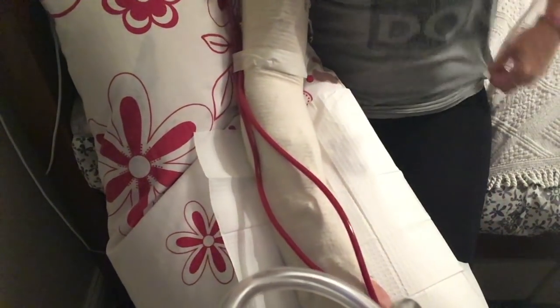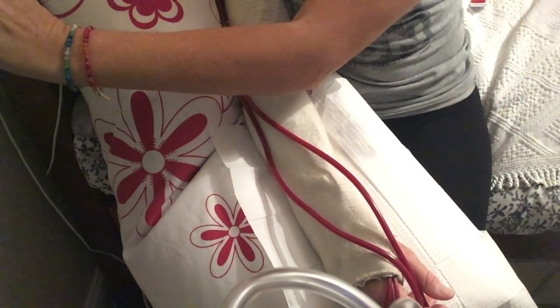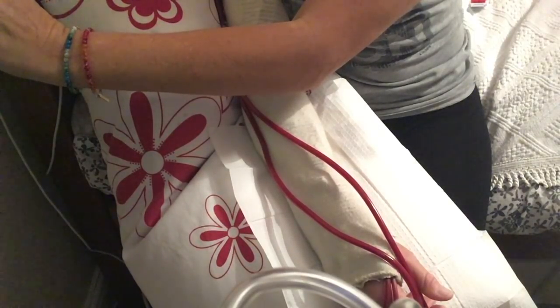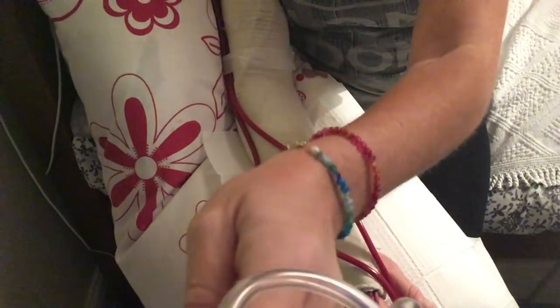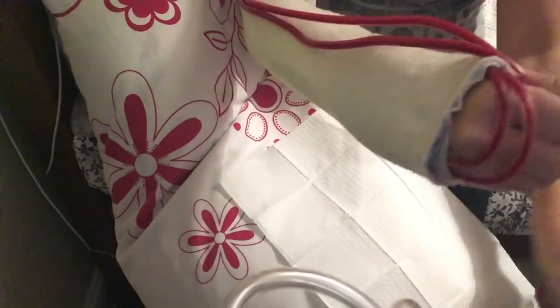I'll turn the pump speed up to 180 now, and give myself a bolus of Heparin. And we're good to go.